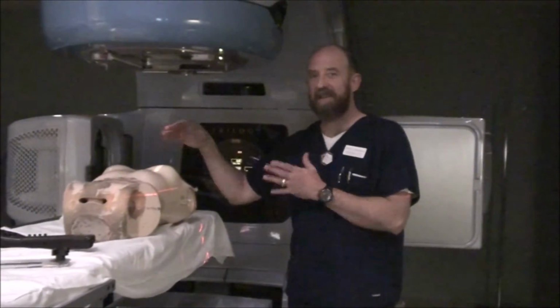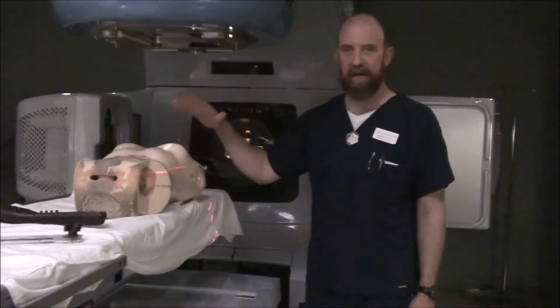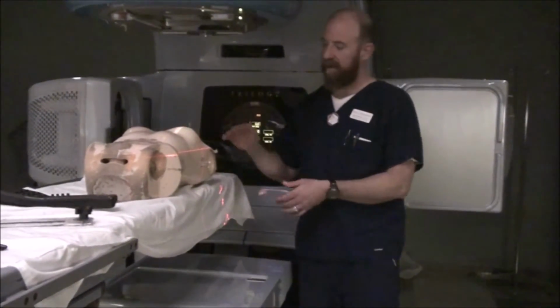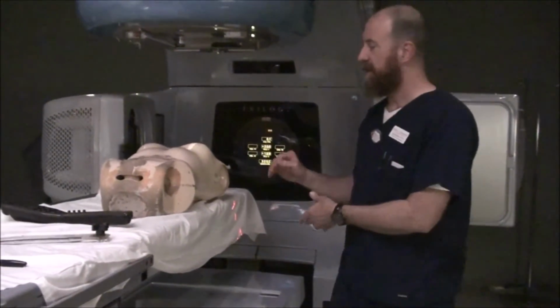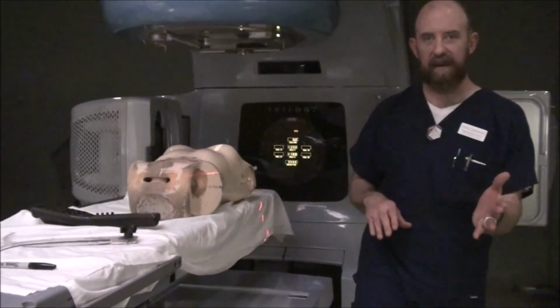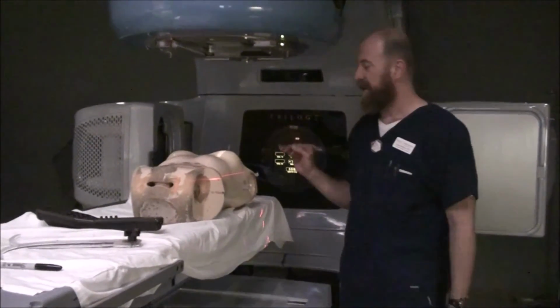If your SSD is going to be within a half, most likely when you do that anyway, you may have to stair step up or stair step away to get to the proper SSD. Either way, the concept of where your entry and exit points are, how to ballpark, why you do your wires, you need to overlap them and have your entry such that you're parallel opposed. You're demonstrating the parallel opposed gantry angle with your wires. Wires of different thicknesses, and always doing the same thickness of wire in the same place so that everyone knows exactly which wire is where, is also very important.